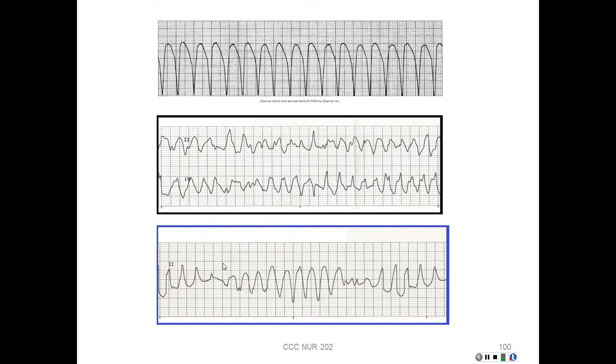The amount of energy you use is going to depend on whether you're using a monophasic or a biphasic defibrillator. I'm not going to try to get into that a lot this semester. That comes as Ms. Lee talks about ACLS more next semester. But typically, if it's a biphasic, you're going to go with 200 joules. If it's a monophasic, you're basically going to start at 360 joules and shock them there.